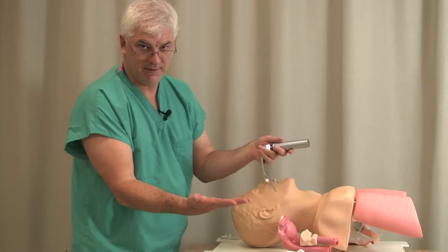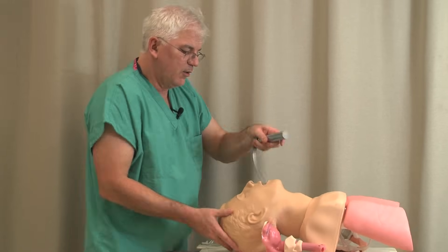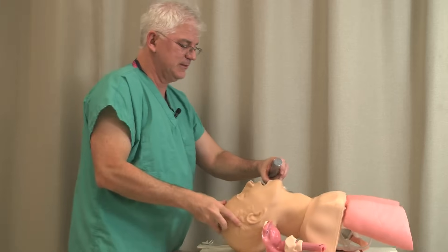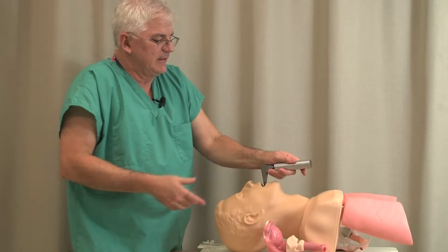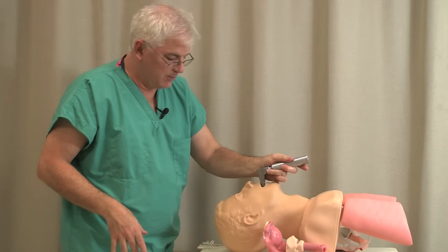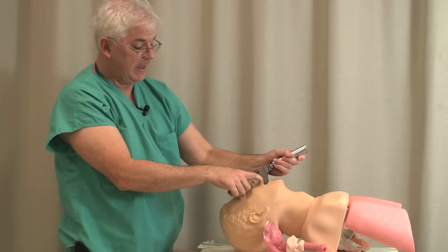Obviously in these and all things I would have gloves on — just for teaching purposes I won't, but you would always have gloves on. You can either get the head in good position, or you can scissors the mouth open — like this. Notice when you scissors the mouth open you go like this; you can't generate much energy the other way. Scissors the mouth open and put the laryngoscope to the right of the tongue — way to the right. Then lift along the direction of the handle. This keeps you away from the upper teeth and affords the best view.